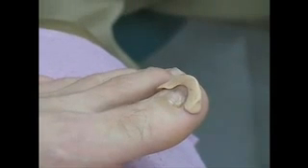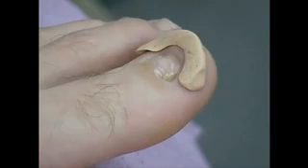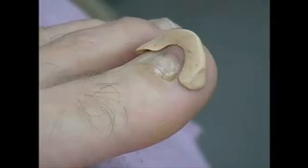I did a little experimenting with a putty where you could go around the sides and protect it that way. The problem is you tended to build up like a wall on the edges, so I think it's better to use the putty just on the distal nail margin.